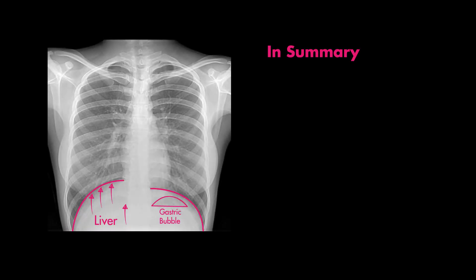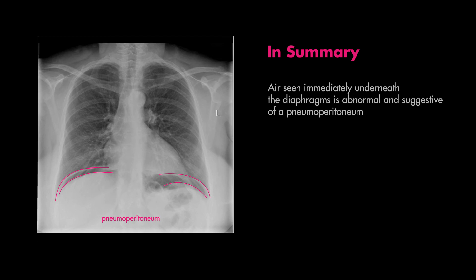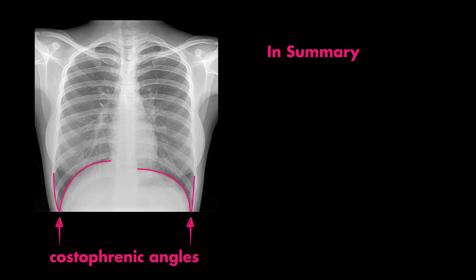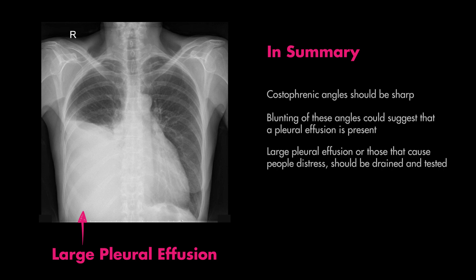In summary, the diaphragms normally have a curved shape. Remember that the right hemidiaphragm will appear higher than the left because of the position of the liver underneath it. Sometimes you can see air underneath which represents colonic or gastric air, but air immediately underneath the diaphragms can be a sign of pneumoperitoneum and should not be missed. Lastly, make note of the costophrenic angles — these should be sharp and well-defined, and blunting of these angles can indicate that a pleural effusion is present.